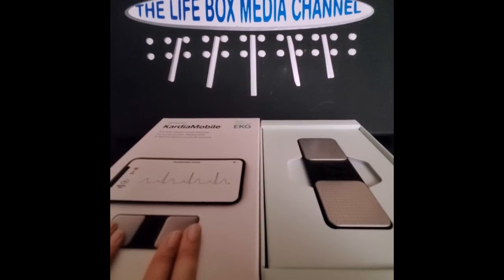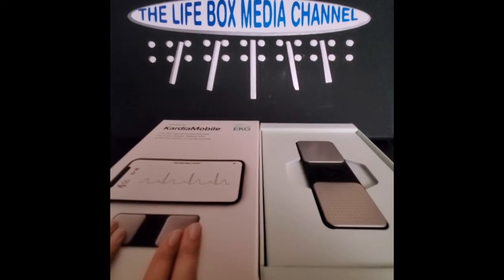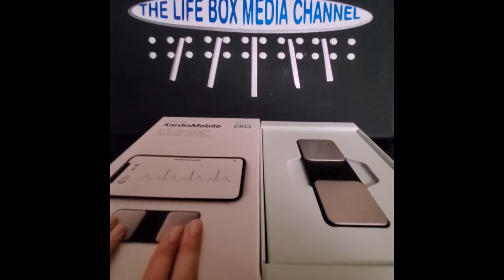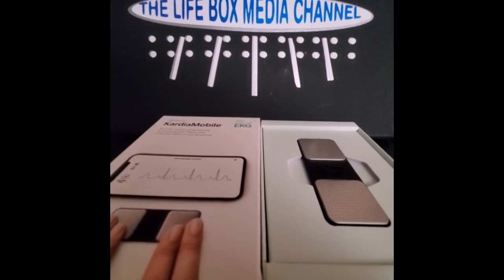Welcome to the Life Box Media Channel. We're reviewing the CardioMobile EKG unit — a cool little gizmo you can get for between $69 and $89 for the regular model, or up to $129 for a better model.